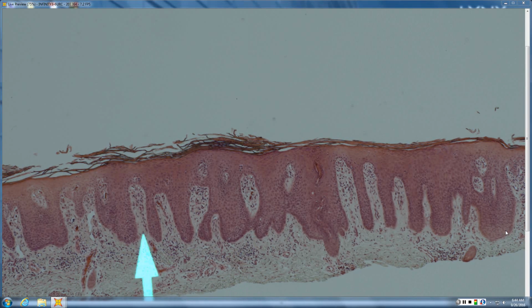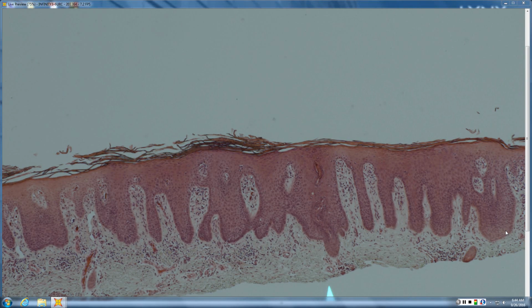And then you get a thinning of these suprapapillary plates, right above the dermal papilla. Now some authors will tell you that that's actually not true. It's more of an optical illusion. It appears that this is thinned. It certainly looks thin to me, but it's actually because of the acanthosis, and in fact this is sort of normal. It just looks thinned because of the acanthosis, whereas in pityriasis rubra pilaris and some other things you actually get true thickening of that suprapapillary plate. So it is helpful to distinguish, but it's not necessarily a guarantee. But generally speaking, we think of that thin suprapapillary plate.